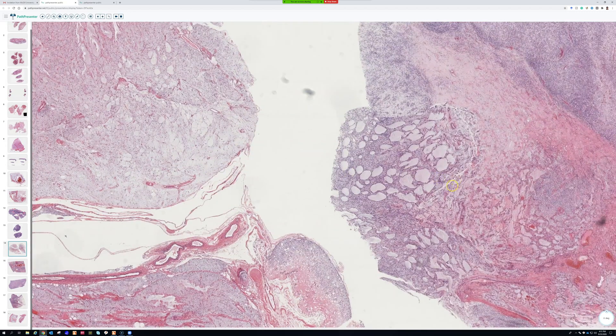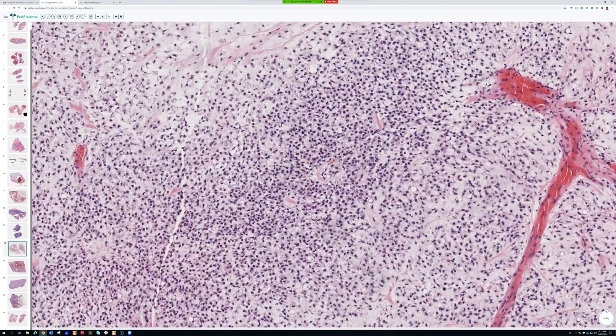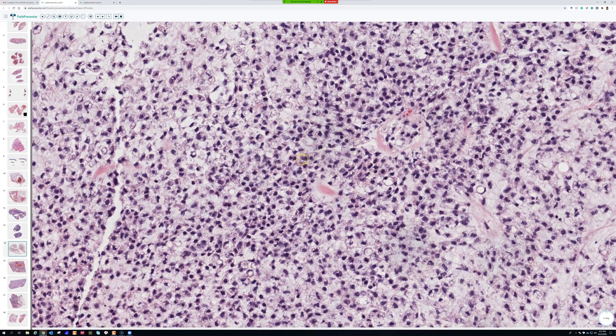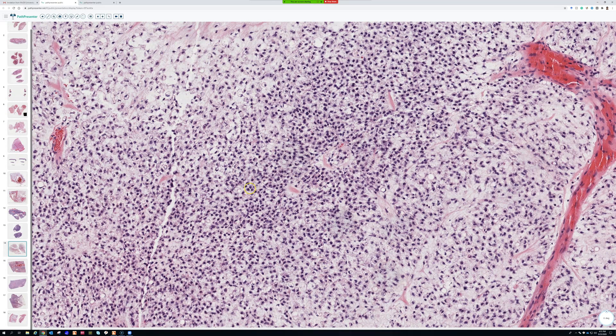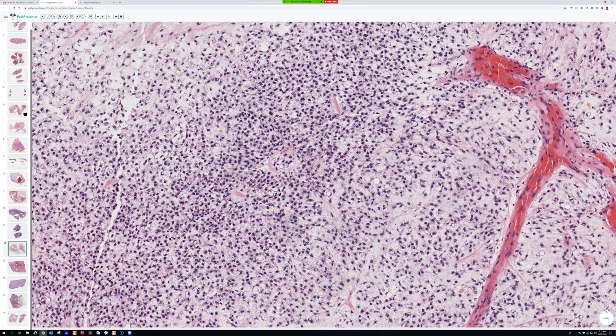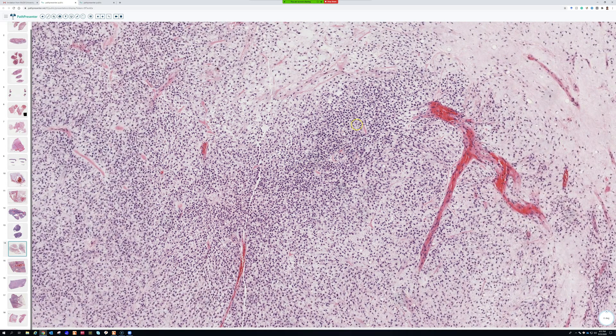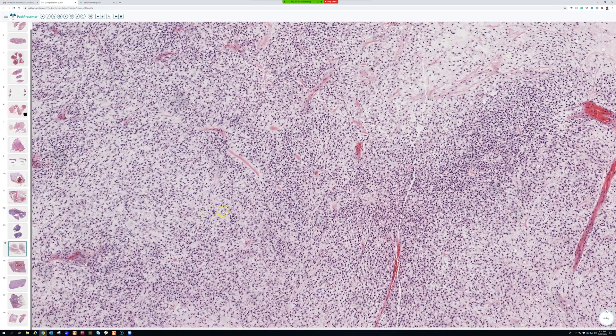Over here, something different is happening — the cells are not doing their social distancing. They're starting to get close and overlap. This is what has historically been called round cell liposarcoma, which is basically the high-grade form of myxoid liposarcoma. There's been a recent trend against using that term. The WHO now says that when more than five percent of the tumor shows hypercellular, larger round cells packed close together, it's a high-grade myxoid liposarcoma.